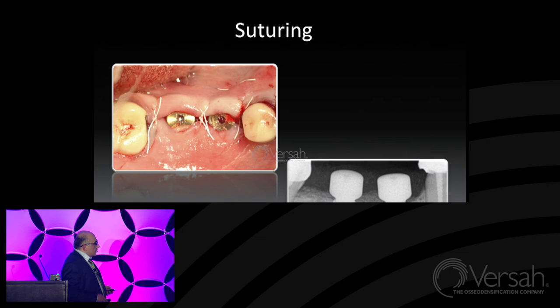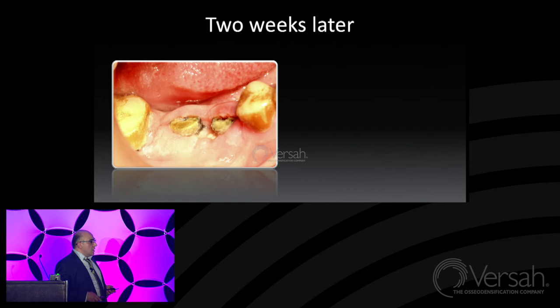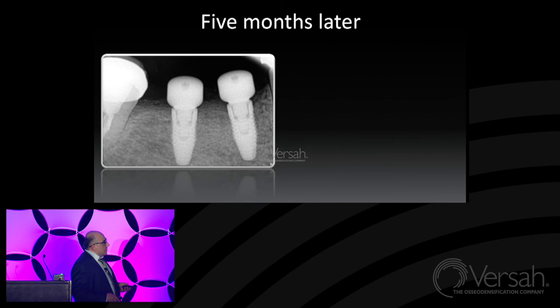Then waiting 2 weeks. Of course, the patient is not able to keep the hygiene at a high level and cannot clean it with the brush. But it's OK. We will handle the situation. We will clean it ourselves. And then waiting some period of time for implant integration. What do we have after 5 months?